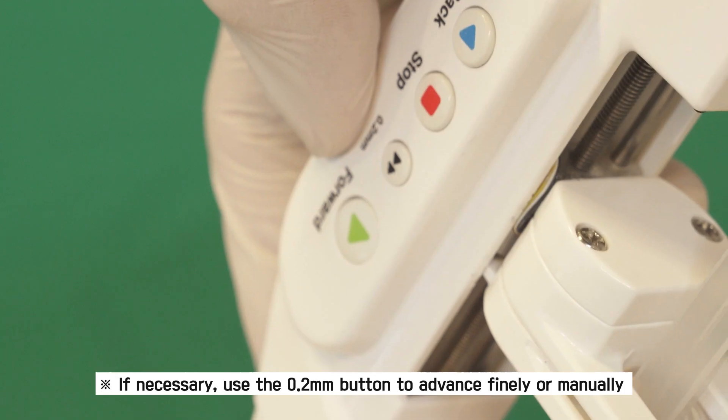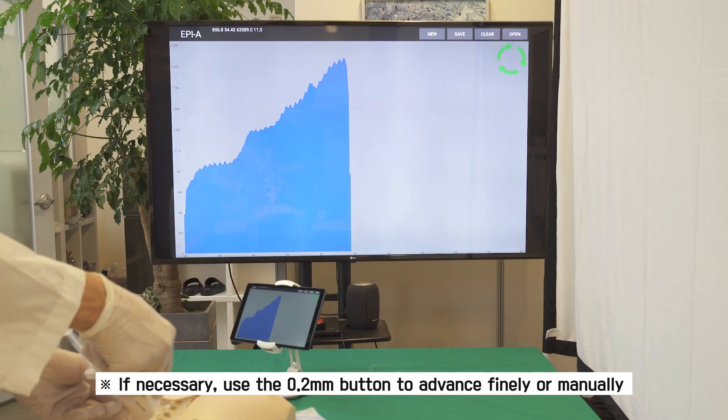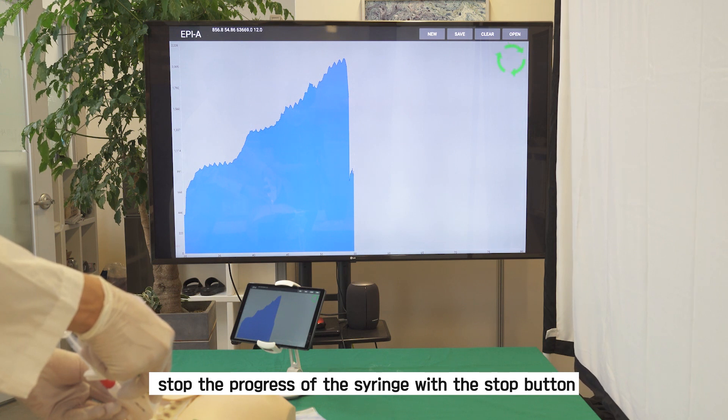If necessary, use the 0.2 mm button to advance finally, or manually stop the progress of the syringe with the stop button.